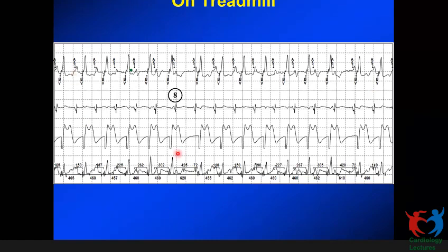This is actually a CRT, basically, as you can see here, biventricular pacing annotation, but the timing cycles are all the same. But there's a nice strip that I got. So it's A sense, bi-pace, A sense, bi-pace going on. Suddenly you find one P wave not being tracked. And also, if you carefully see, the PR interval is gradually prolonging. This looks like the intrinsic Wenckebach behavior. This is the pacemaker Wenckebach that can happen. We'll see why it happens.